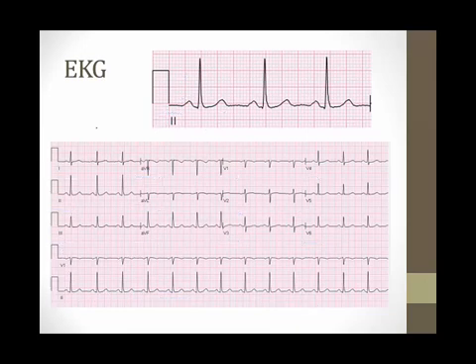So most students understand the P waves and the QRS complexes and what they represent. But what's often tricky to understand is what each of the different leads on the surface EKG represent. Notice that the QRS complex in lead 2 is all pointing upward. Notice that the QRS complex in lead AVR is all pointing downward. Notice that in lead V3 the QRS complex is pointing slightly upward and slightly downward. We have to explain this.